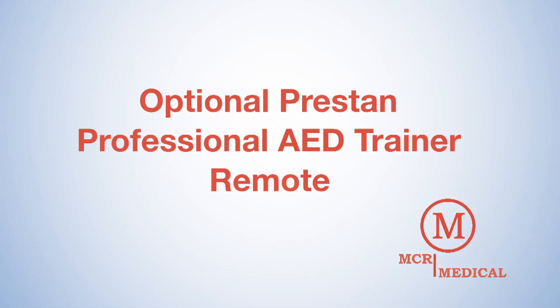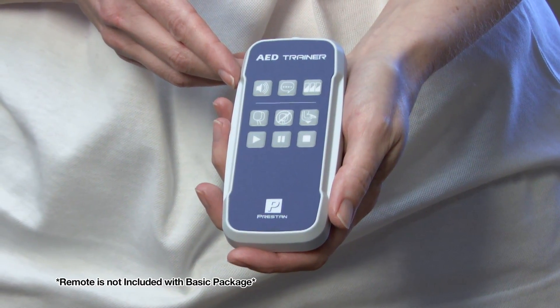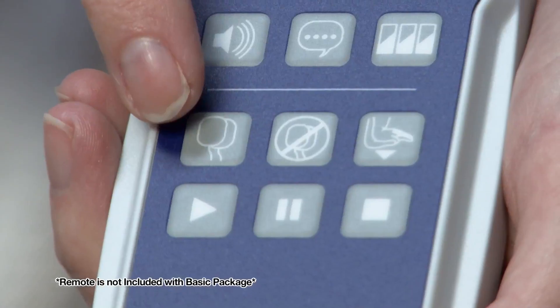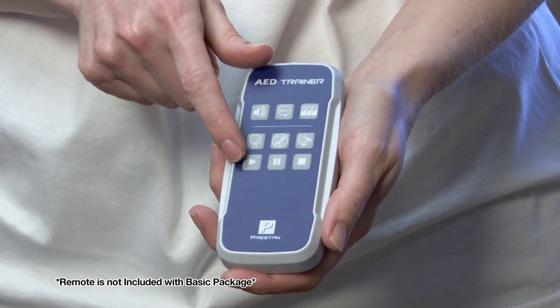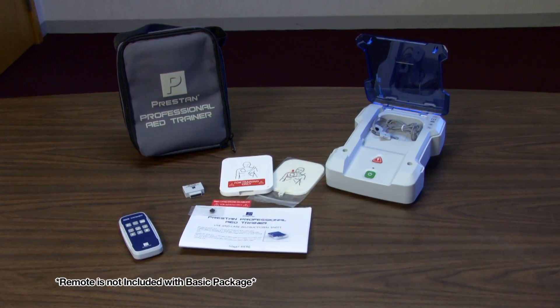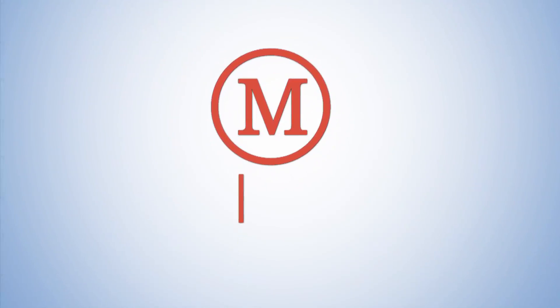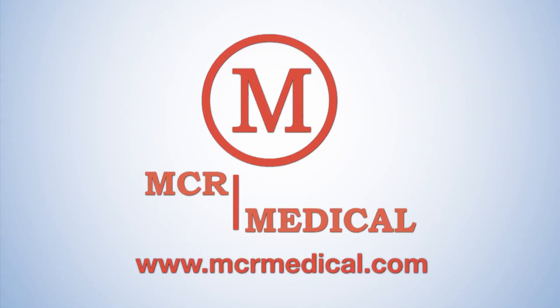The Optional Remote Control. With the Optional Remote Control Device, setup and unit control functions can be operated remotely within 9 feet of the trainer. You can adjust volume, set language, change the scenario, simulate loose pads, initiate a press-deeper command during CPR, and play, pause, or end the scenario. The remote control is not required to operate the unit. To order additional or replacement pads, the Optional Remote Control, or to view the entire MCR Medical Supply catalog, visit us at MCRMedical.com. MCR Medical Supply — your premier source for first aid and CPR training supplies.